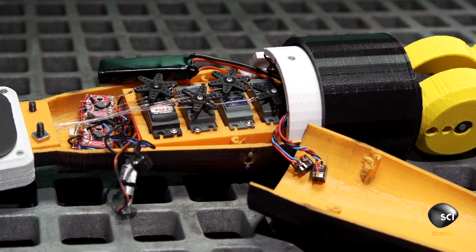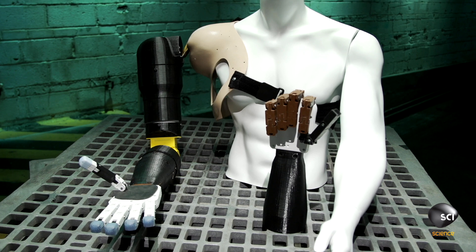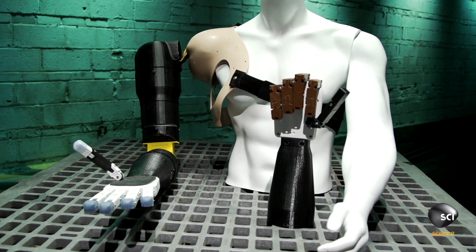These guys have incredible ambition, but going from prototype to production, that'll be a huge challenge. They have to tailor every RoboArm to the user, and every RoboArm they produce not only has to work, but it has to work flawlessly. There is no room for failure when the point is helping someone regain their mobility.